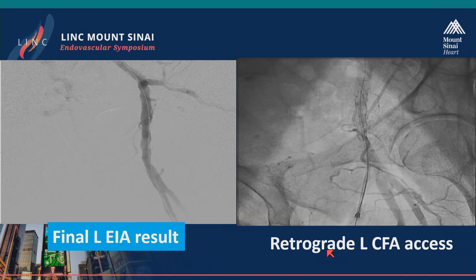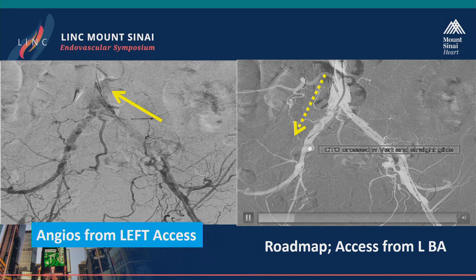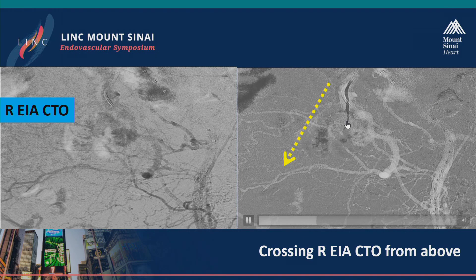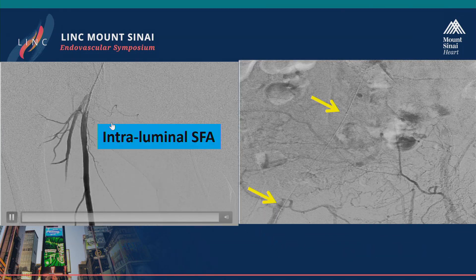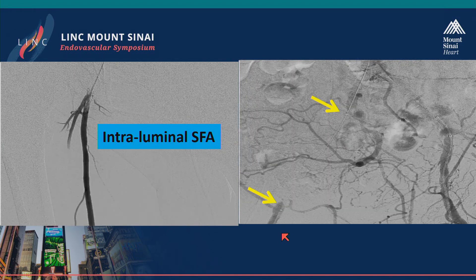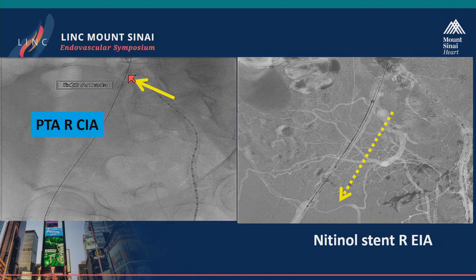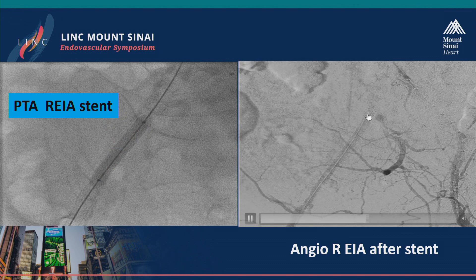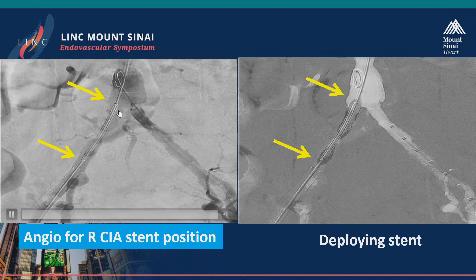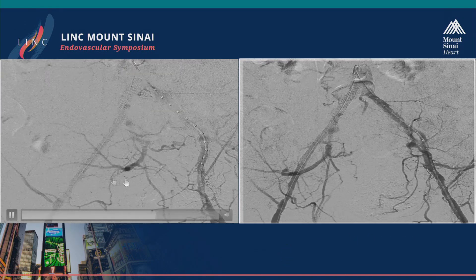It facilitates a micropuncture five-French sheath below to continue with a catheter from the left to help guide us on the right. Then with a brachial shuttle sheath, we start to work on the right external iliac. Here's that nub, and we like to go antegrade if possible and try to stay in the lumen. Here's confirming luminal position. It's very important to get information from your pre-dilatation in terms of length. We did a little pre-dilatation of that common iliac lesion before placing a nitinol stent guided by road map. We post-dilate most nitinol stents, and here's the result in the external iliac CTO. Then back to the common iliac where we need more precision — a catheter from the other side allows very precise positioning of our balloon expandable stent, and here's the final result in all three lesions.